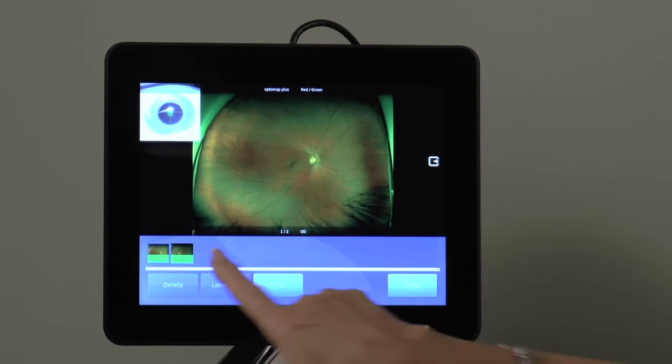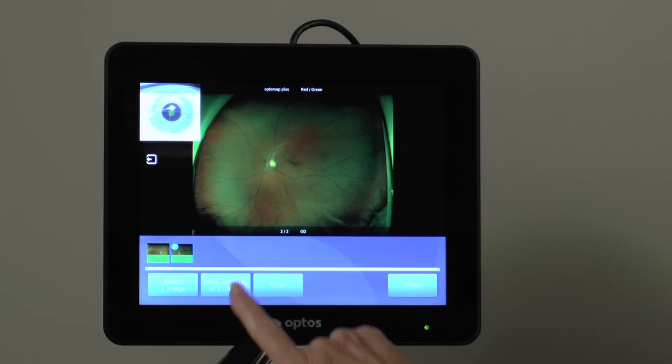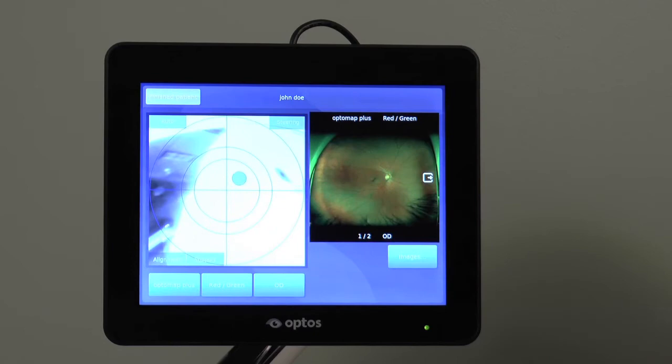If an image is not labeled with the correct laterality, it may be changed by selecting it and touching the swap laterality button before closing the image review screen and exiting the session.